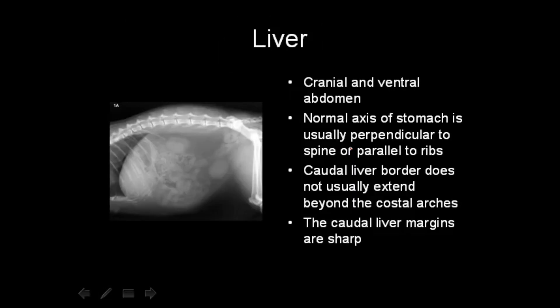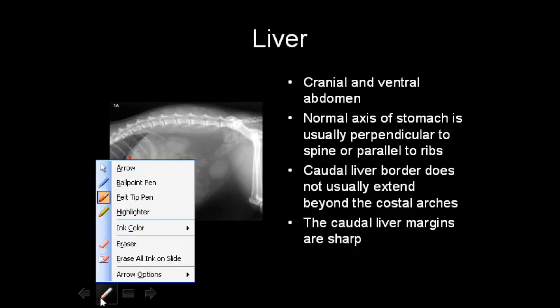Starting with the liver: the liver is cranioventrally positioned and normally is within the ribcage, and that is an important factor. Another important factor is that the caudal edge of the liver is quite pointy, quite sharp.